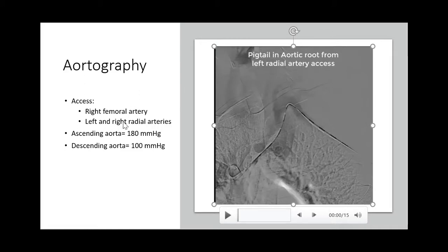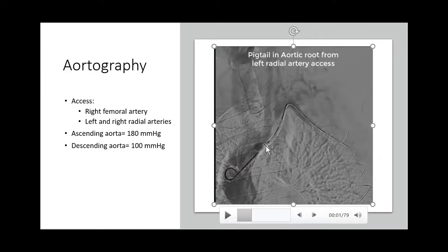For aortography and left heart catheterization, we had access from the right femoral artery and left and right radial arteries. Ascending aorta systolic blood pressure was 180, and descending aorta systolic blood pressure was about 100 mmHg. The catheter is now in the aortic root via the left radial artery axis, filling the ascending aorta and its branches.